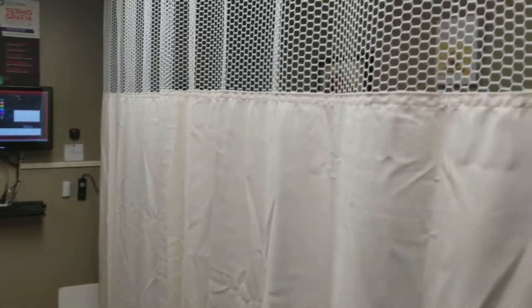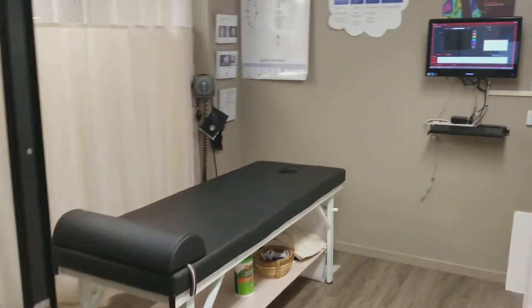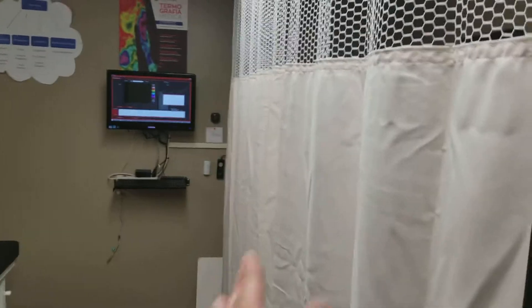This is our setup here. We have our room — I'll show you from this direction. Here's our room; it's our exam room. We come into it and as you can see we have a privacy curtain set up here for thermal imaging.